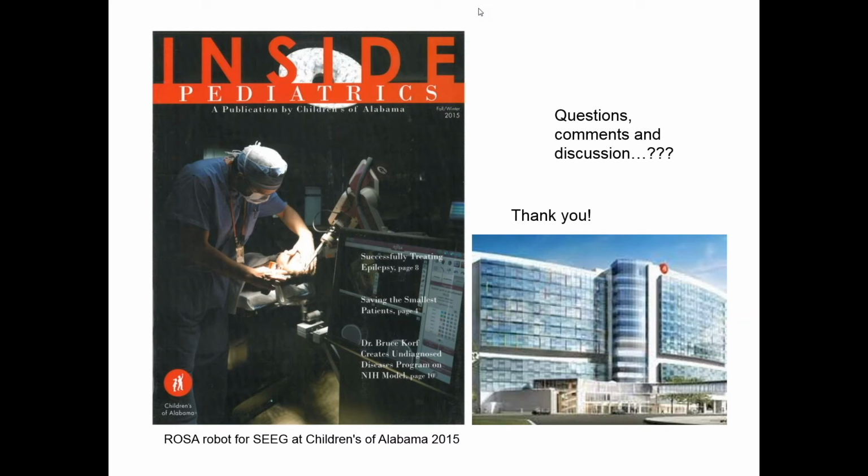But from the limited experience we have right now, from the vantage point that affords me, I think the SEEG is very, very well tolerated. Grids can be managed, but they are more uncomfortable. There's just more going on. Now, whether or not it gets a better look, that's a harder call at this point in time. Our results seem very good right now, but to do this optimally, scientifically and in terms of proper outcomes, we should wait for more numbers and more time.